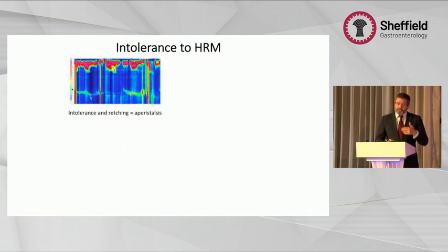On that note, even if patients don't present with vomiting, but if they have the catheter inserted and they begin to vomit and they're intolerant, not uncommonly, there is a problem with interpreting pathology. And so we can see this motility or lack of motility as a consequence of the intolerance to the catheter. And it's very important in this context not to use what we see here as the disorder.